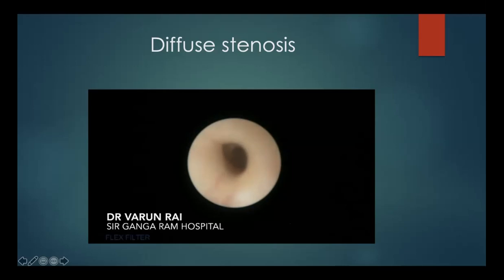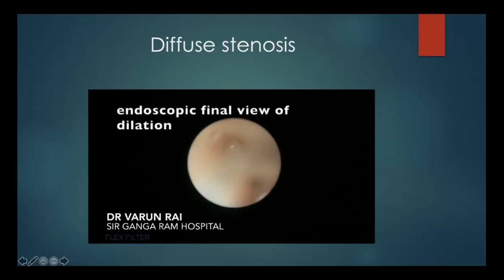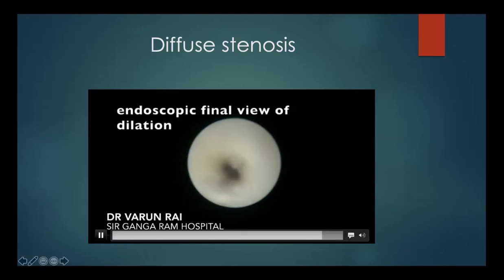And this is me withdrawing the endoscope, and you can really see the whitish change of the mucosa. You can see your trauma because of your forced dilatation. I'm sorry about the bubbles, but that's because we like to flush the steroids throughout the ductal system, and you can appreciate that subtle change in the mucosal color. Now it's absolutely white.